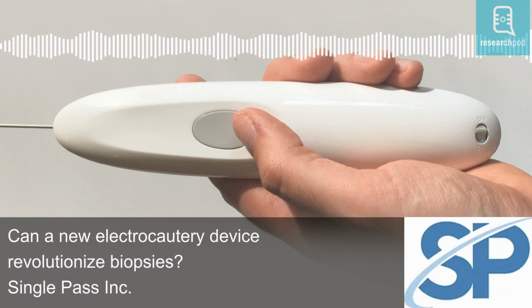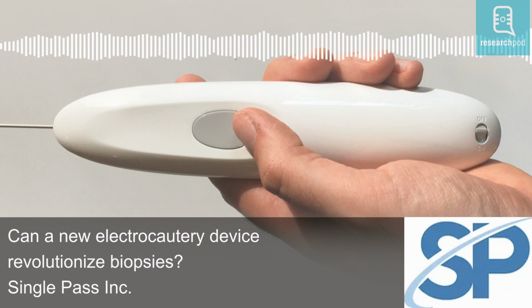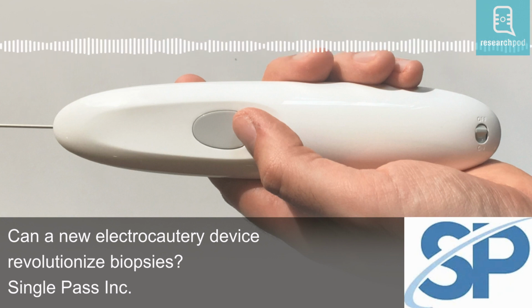Firstly, blood loss measured at the biopsy site 1 hour after the operations. Secondly, researchers took into account the absence of observed bleeding after 8 hours. Next, they recorded the absence of hematoma formation after 14 days post-operation. After the 14 days, patients were also given a questionnaire, asking about any other adverse effects they may have noticed. Finally, the total time spent in the hospital was recorded.